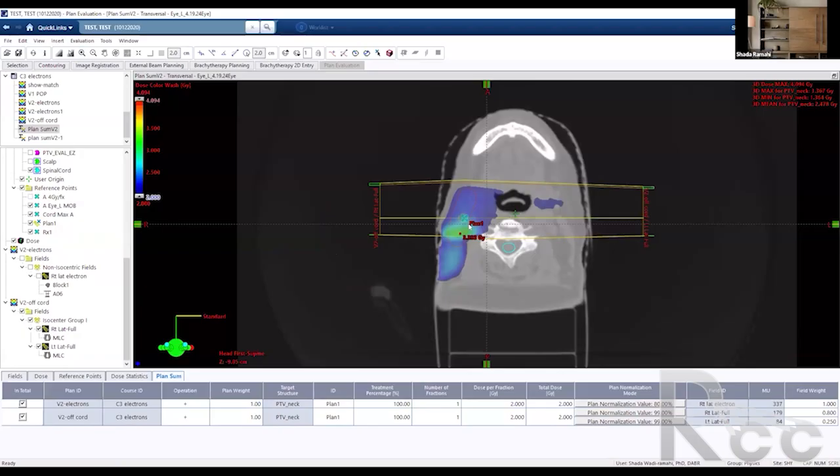And honestly, there is no way for you to remove them. Because having photon alone, you have a perfect plan. You have electrons alone, you have a perfect plan. If you try to add a wedge or MLCs, you'll be underdosing everything else in the path of the beam. I mean, you could try if you want.